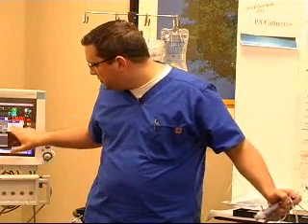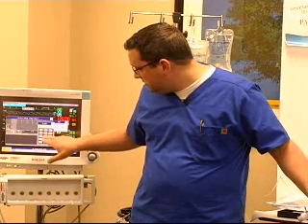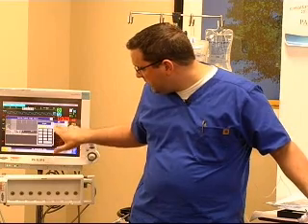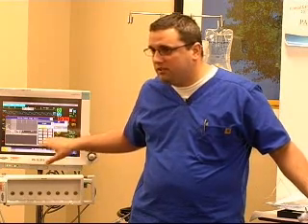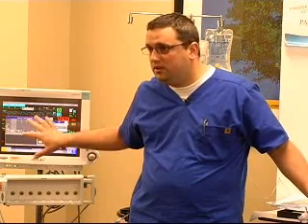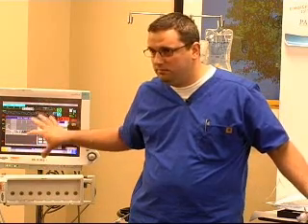And the other thing, of course, is your BSA. Now this one is in inches, so ours is in inches as well, but also your height and weight. Your weight in this one is actually in pounds. In our monitors, it's in kilos. So please don't get confused, but when you go to put it in, make sure you're using the correct units based on what's in the monitor.